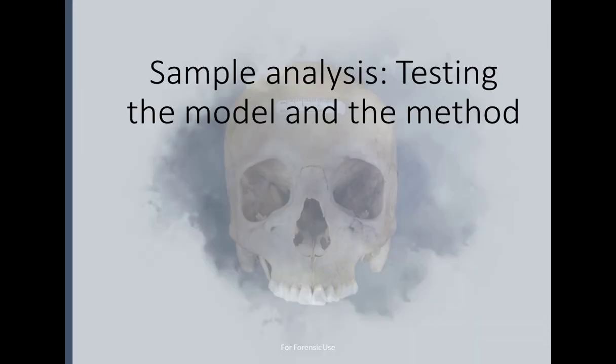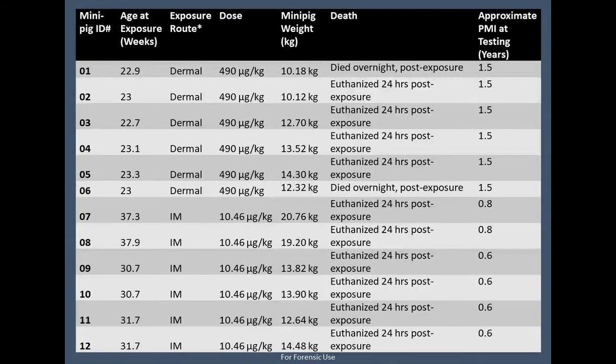So let's move on to sample analysis and testing this method with a set of real samples that we were able to obtain through the U.S. Army collaboration and through a study that they did. And so they had a small study in mini pigs where they gave a dose at a certain amount of weeks, and you can see the dose listed for each of these individual animals, either a transdermal or intramuscular dose was given.